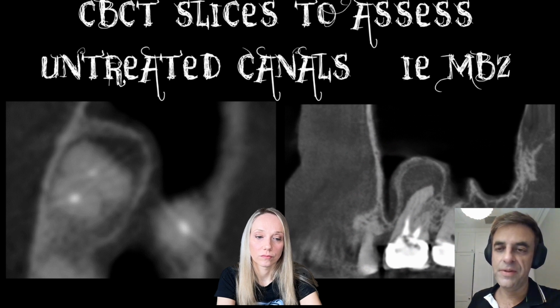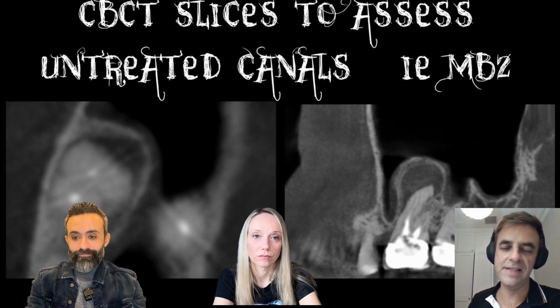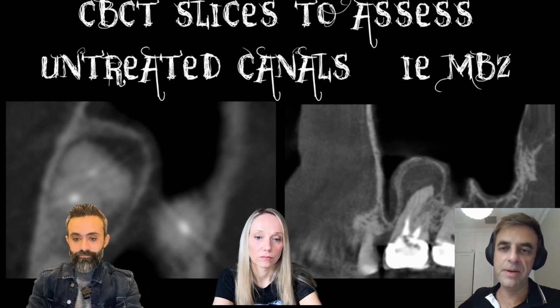They have that thin MB2, or should I say figure 8? I like to call it figure 8. It has that kind of shape where there's an MB1 and 2 together. So they almost always join up in upper 7s.